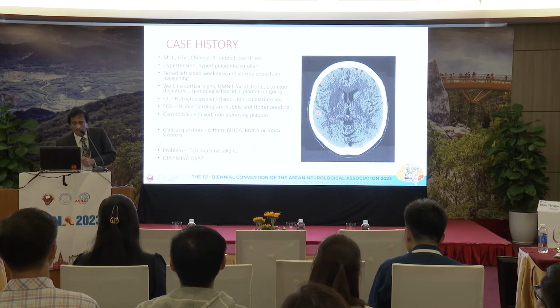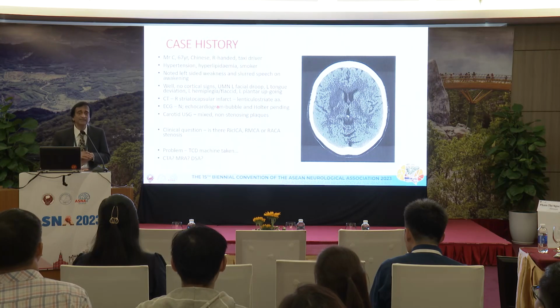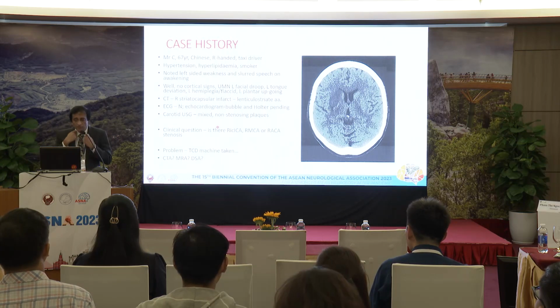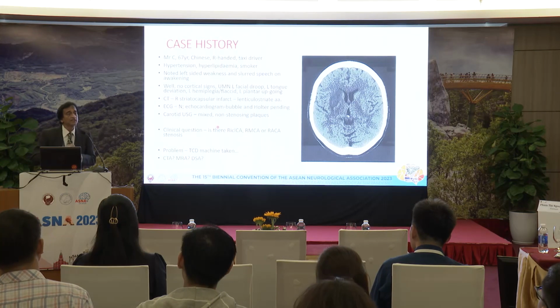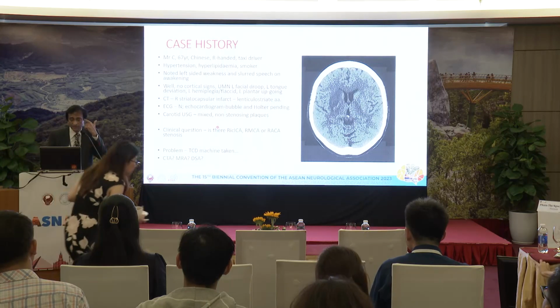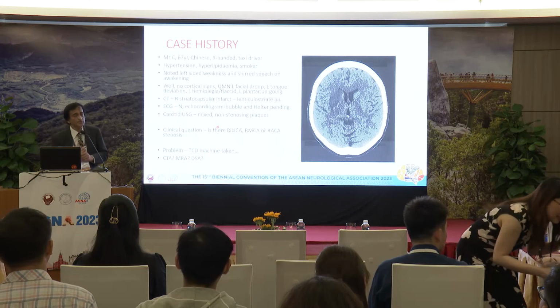The ECG has been done, it's normal. The echo and the Holter are pending. The cardiologists are having lunch. They have no time to do the study for you straight away. So you have the speakers here do the ultrasound for you. It shows some plaques, but they're non-stenosing. The question is, is there stenosis in the right internal carotid artery, or intracranially, the right MCA or ACA? That's the question you ask.